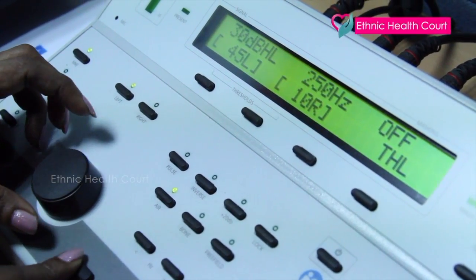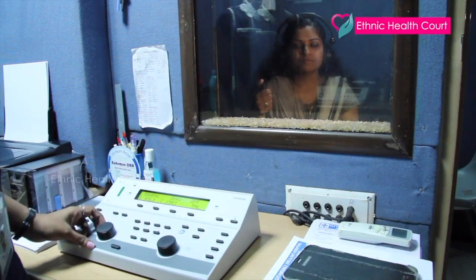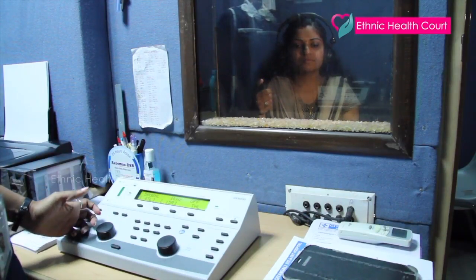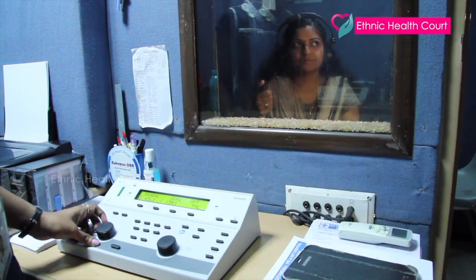We are testing the headphones. The audiologist uses a few different headphone types for the patient. We can test an audiologist's range of sounds.